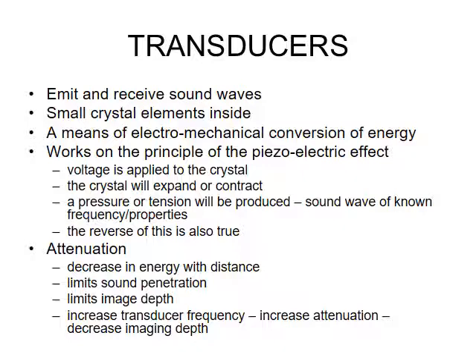In terms of energy conversion, this is referred to as electromechanical conversion. They're changing electrical energy into mechanical or movement energy, and vice versa. So just remember that that's what the crystals are doing. They're very fine, very sensitive, and as I said, you have to be very careful that you don't go dropping the transducers, because the crystals can move or can break.